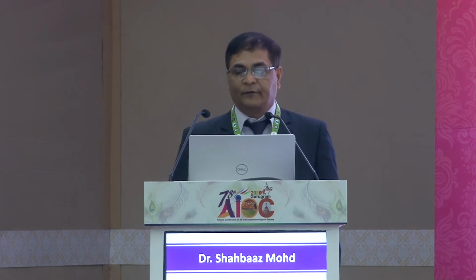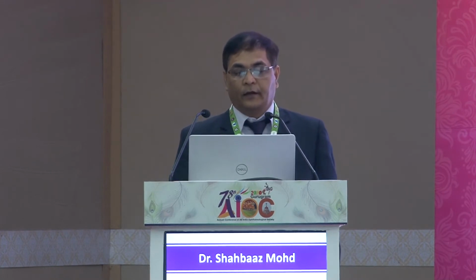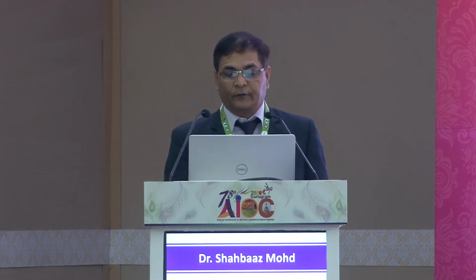It is important to know the velocities of sound, because nowadays all the machines have them fixed already. They will calculate, for example, phakic eyes at 1555, and similarly for aphakic eyes and so on. We should know this because the axial length will differ. If it is not proper, it may be high, it may be low, or it will not be right. So we should know at least this.